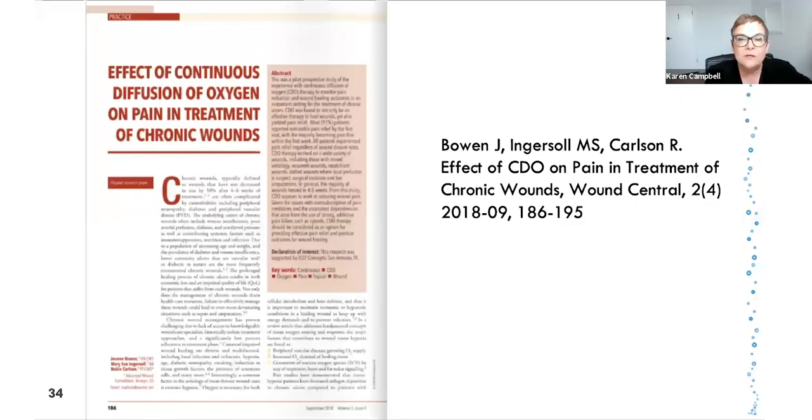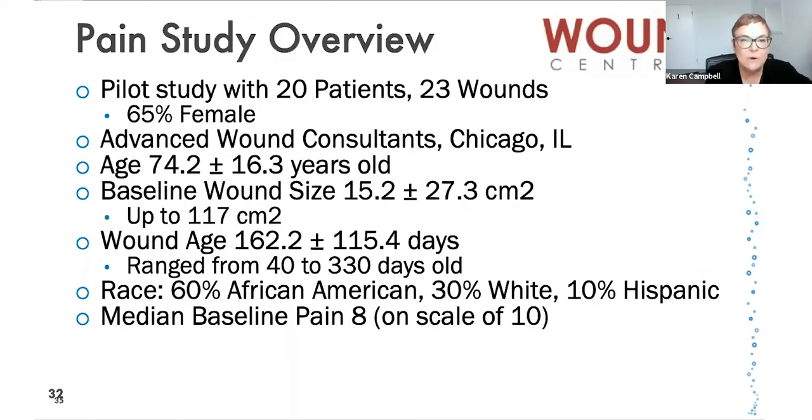So now I'm actually going to switch over and talk a little bit about our study that looks at the effect of CDO on pain and treatment of chronic wounds. And you can see the reference there. And this was a pilot study with 20 patients in 23 wounds. Most were female, and it was done in Chicago. You can see the average age is older than the diabetic foot ulcer, and the wound size was bigger.